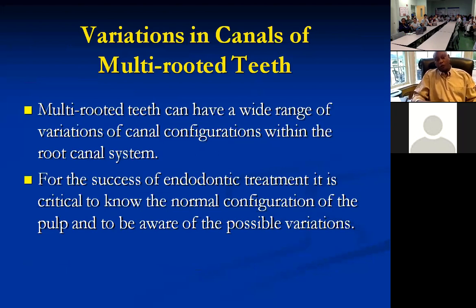So now we have an idea that most of these upper molars have 4 canals, and we find them. We use microscopes, we use ultrasonics, and in endodontics, that's our goal, to try to find those canals. So we know the incidence is higher than what we've been led to believe when you compare it to Frank Wine's study back in 1969.